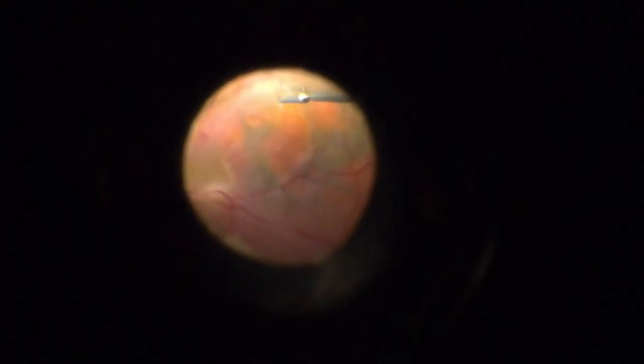Better. And you can see what we're trying to do there, trying to keep this centered for you guys. And we grab that flap we made in the ILM. Sometimes you can get the ILM to come with the ERM, but sometimes you have to peel in two layers in a more severe ERM like this. But once it comes all at one time, fine by me. Now I'm peeling towards the nerve there. I will almost stop and go the other direction. But it's nice to go around too, if we can.